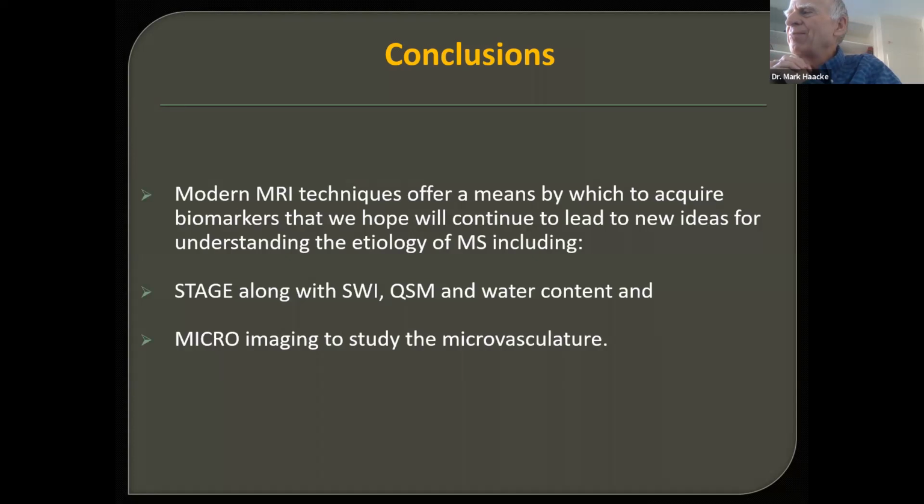The medullary veins are only around 200 to 300 microns across. So actually, we have just started to create some imaging that is about 250 micron by 250 micron cross section. And we've actually scanned a few normal volunteers to demonstrate that we can measure the blood flow even in those small vessels. And so it should be much easier to do that in the ependymal vein.